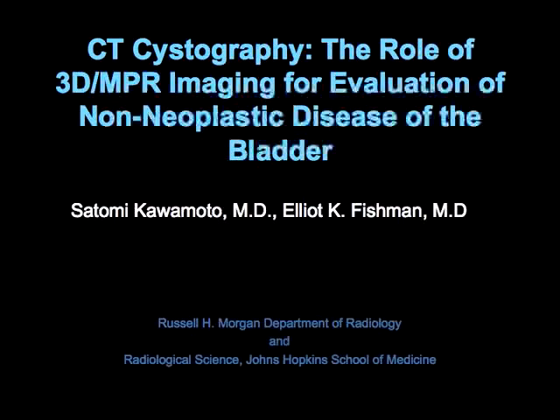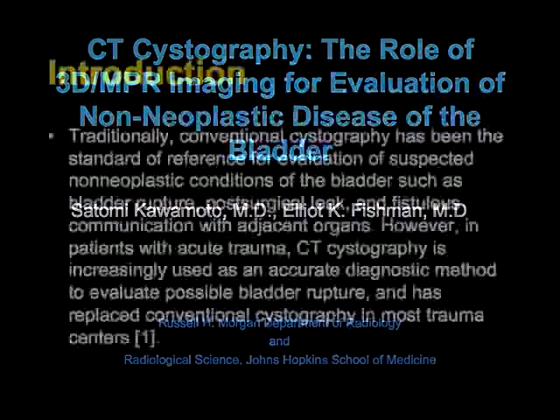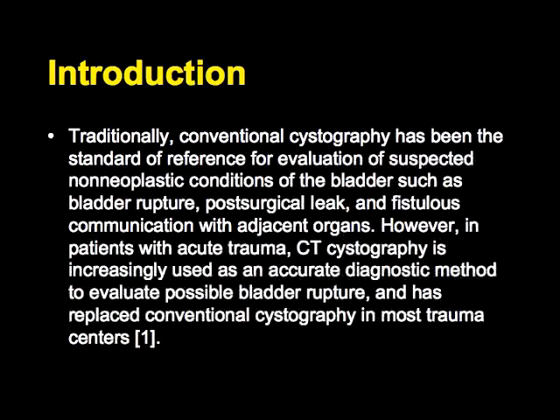So traditionally, cystography was done for many different conditions. It was done in the trauma situation. It was done looking for fistulae. It was done for post-surgical change, post-surgical leak. But we've noticed, of course, and many have, that CT is an ideal study. Now, in saying this, most of the work looking at the bladder with CT, in terms of cystography, was in the trauma scenario, where you knew that CT was indeed very good and had replaced conventional studies, and of course can be done very conveniently in the trauma center.